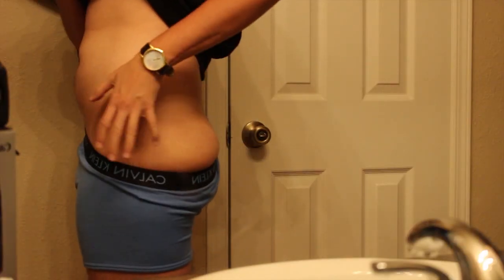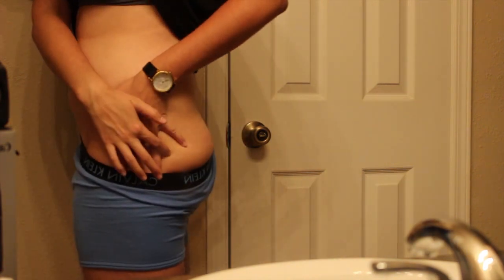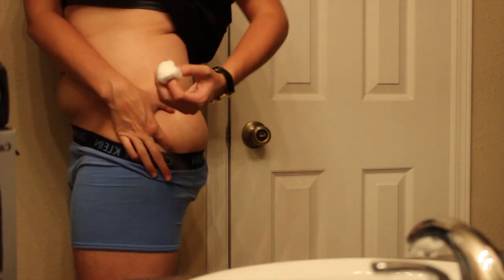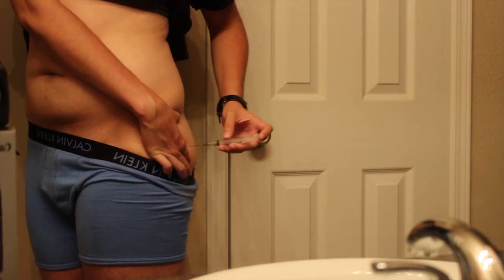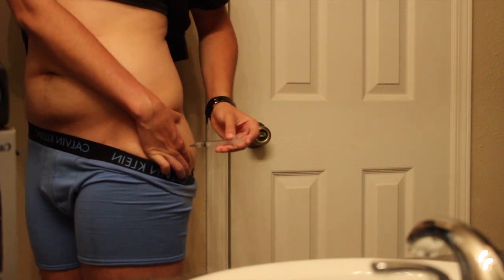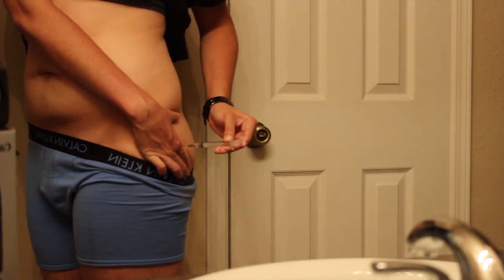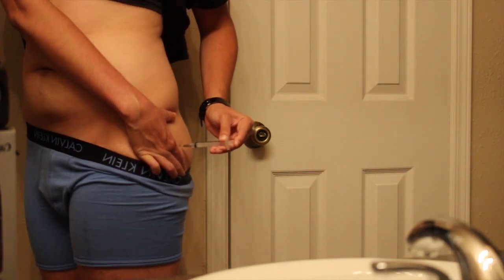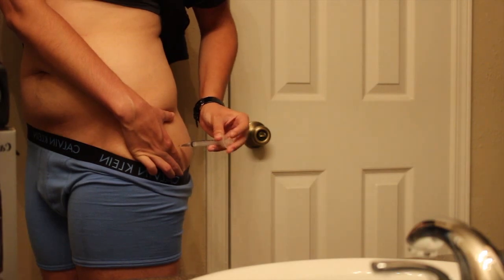To measure where I'm going to put my needle, I take my thumb on my hip and between the ring finger and my pinky — that's where I'm going to inject. I take the cotton ball and wipe that area before injecting myself at a 90-degree angle, making sure that the needle goes all the way in so that the testosterone is going into the muscle. Then I push and make sure that all the testosterone is gone before I pull the needle out.